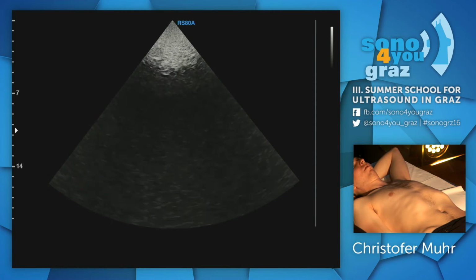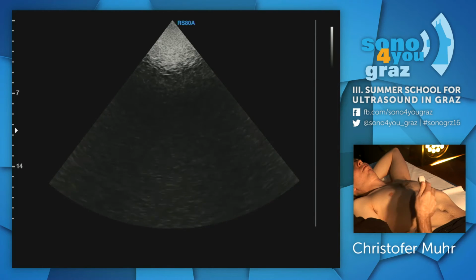So the movement I did was for the IVC, I turn it like this, and for the short axis, I turn it the other way and look a bit more towards the apex, okay? So we can practice that in the afternoon if we have time.